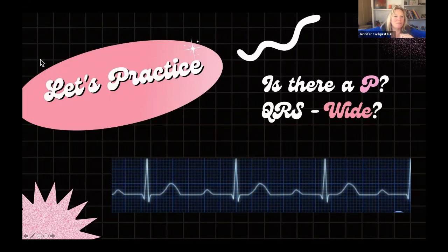And Samantha says prolonged PR. Cheryl and Chris, and actually everybody on here that's saying something is getting it right. And also Facebook. This is a first degree block. Okay, so it is a little bit slow, but it is a first degree block. What I want to point out on this one is this interval, beginning right at the beginning of the P to the R, this is called the PR interval. And this should be no more than one big box or 200 milliseconds. So this is definitely too long.